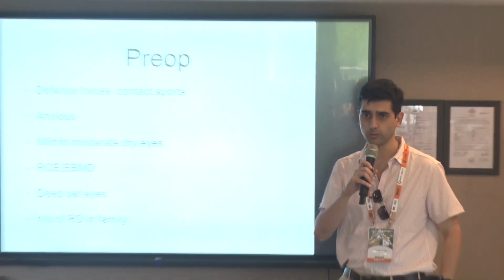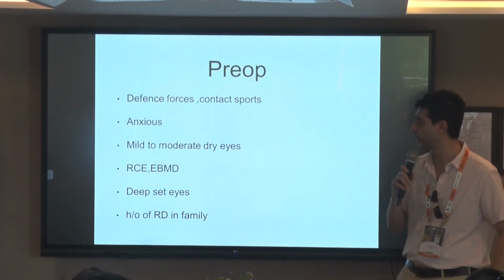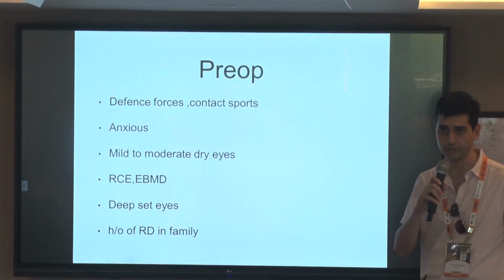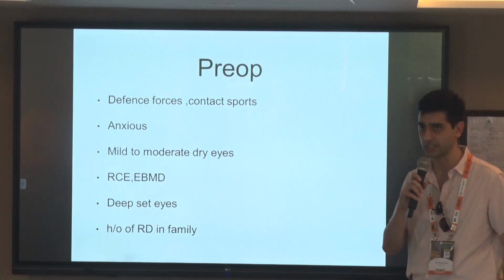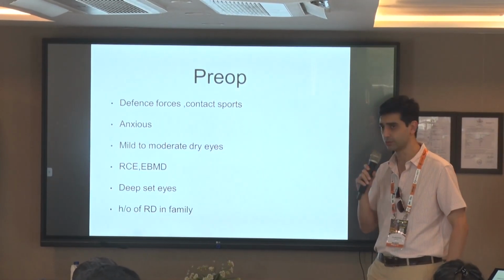Your choice. So let's start with pre-op. In pre-op, low powers. Most of the patients who we get for low power corrections are the ones who want to join uniformed forces or are into contact sports. Then this is a no-brainer that you would do a surface ablation for them. Now, if you have a patient who's very anxious and you might have chances of suction losses, then again, a surface ablation would be the procedure of choice.